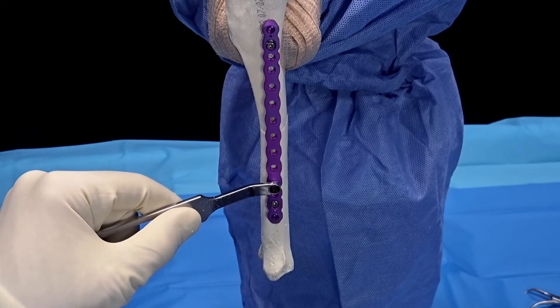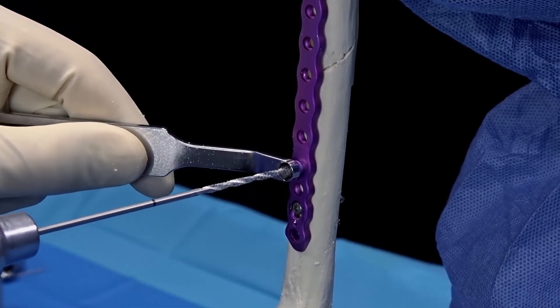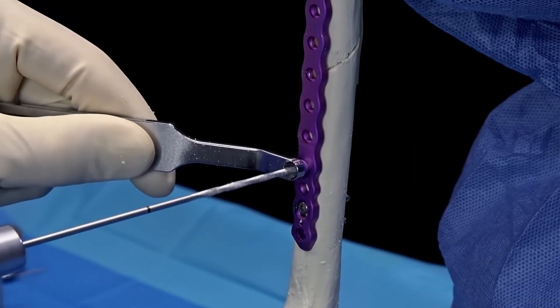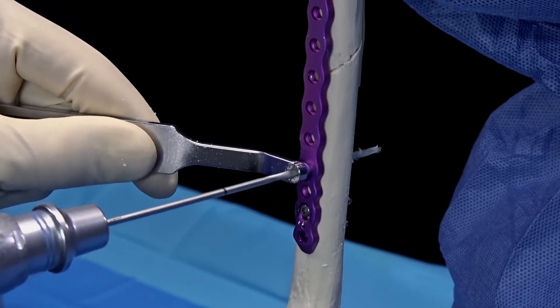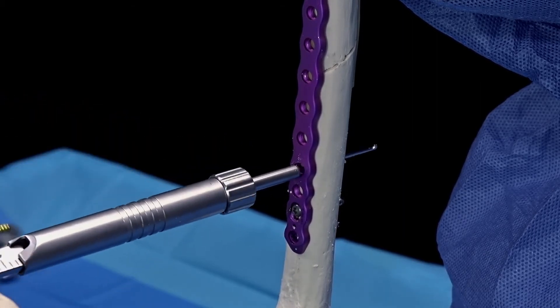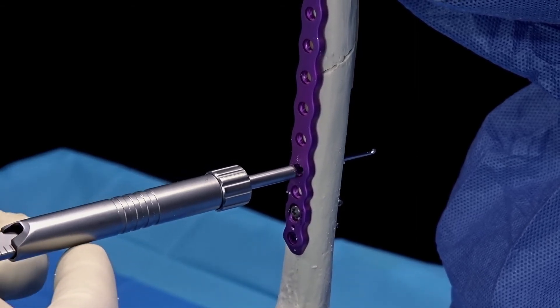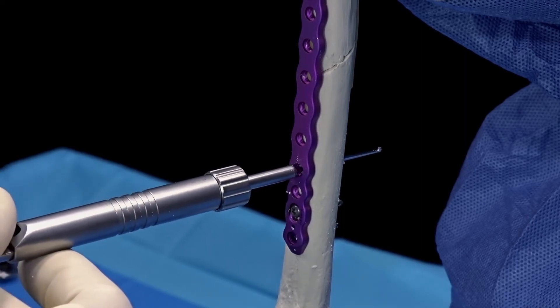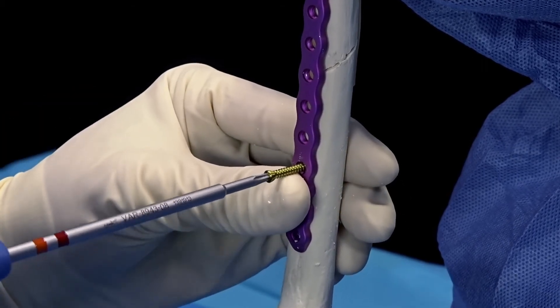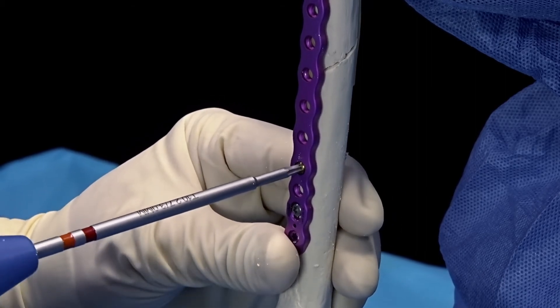The conical shape drill guide is placed for using the variable angle locking screw. This conical guide allows us to freehand drill 12 degrees from center in any direction. We use the same 2.3 millimeter drill bit to penetrate the near and trans cortex. The guide is removed and we measure as shown. The trajectory of the hole is noted prior to removal of the drill guide so this trajectory can be matched with the variable angle locking screw, which is golden in color to indicate it is variable angle and can be deviated from the neutral axis.